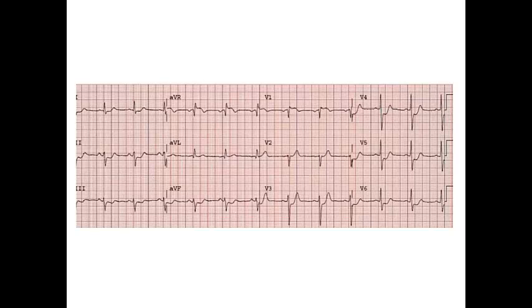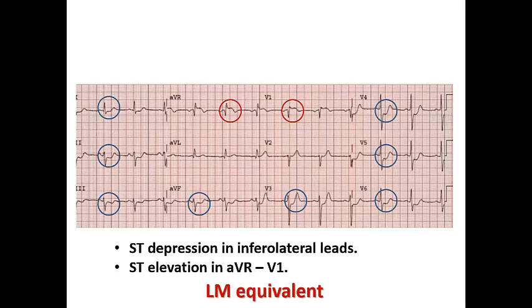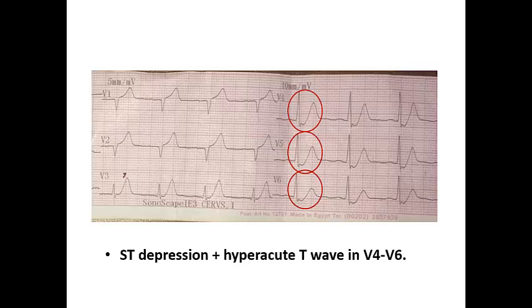In this ECG there is ST depression in the inferior leads — is it non-ST? No, because there is frank ST elevation in AVR and V1. This is a left-main equivalent and this patient should be considered for urgent invasive coronary angiography, treated as STEMI. In another ECG with ST depression in V4, V5, V6, but also hyperacute T-waves — this is DeWinter syndrome, and the patient should be considered as anterior STEMI, not non-ST elevation ACS.